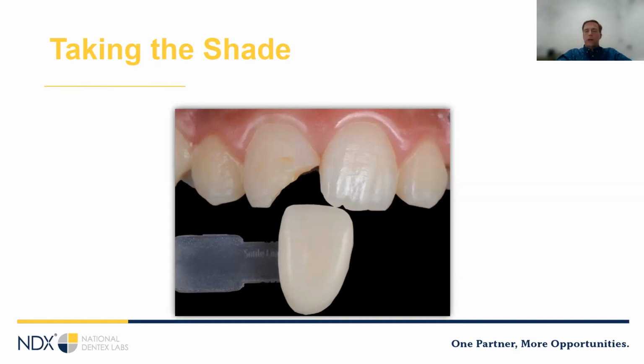Good photos are critical to capturing good color information. In your laboratory, some of you probably know this, but if you send in a patient for a custom shade, most of the time the hard work in the laboratory is getting really, really good photos. So if you can get really good photos, you can get very similar results to a custom shade without sending your patient to the laboratory.